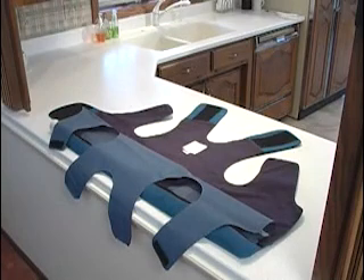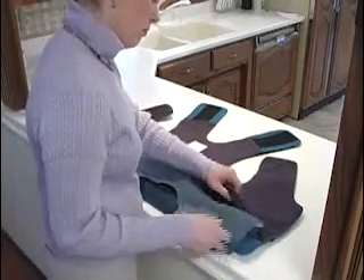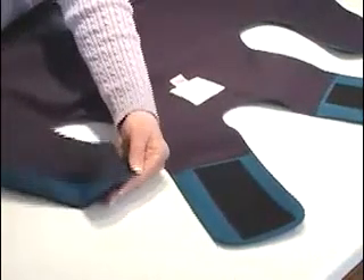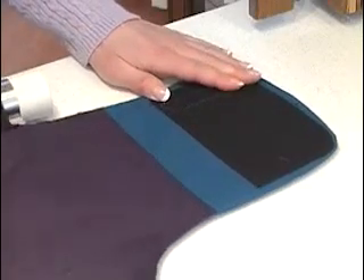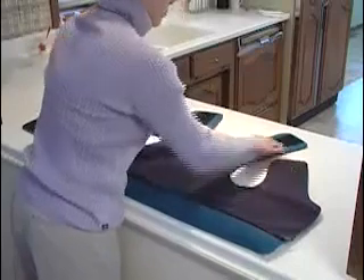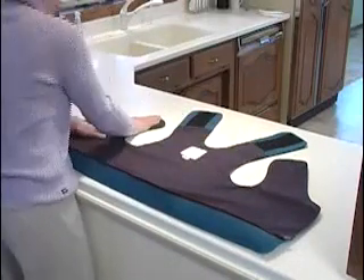Working on a flat surface, place the bladder into the shell. Tuck the four shoulder straps of the bladder into the shoulder straps of the shell, working the ends into the corresponding pockets. Be sure the Velcro attachment points are firmly connected. Also attach the fifth Velcro strip located near the air hose connector. Check the bladder position, readjust the Velcro attachments where necessary, and then close the zipper.